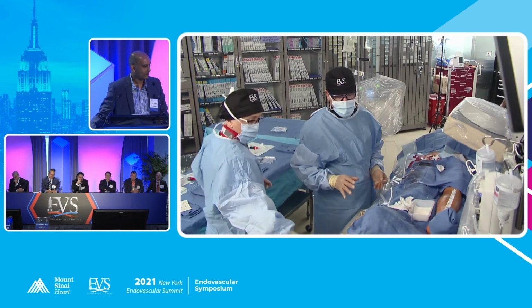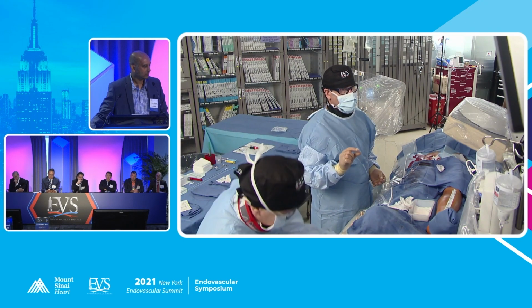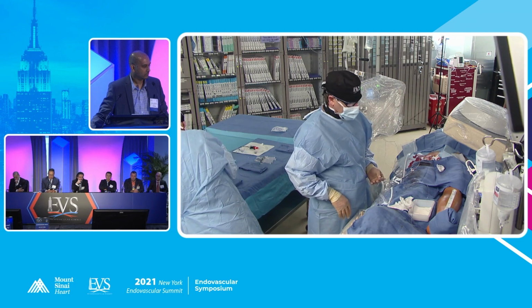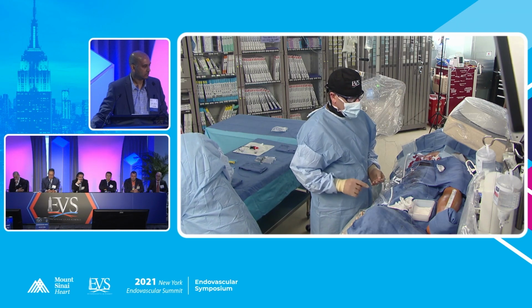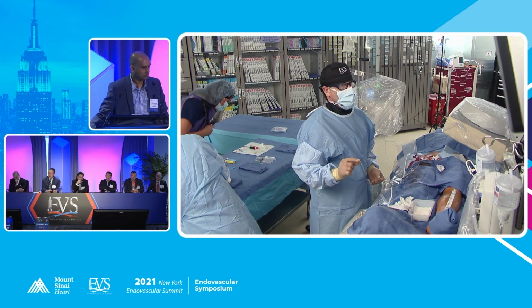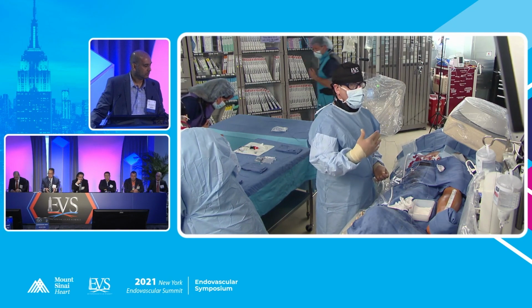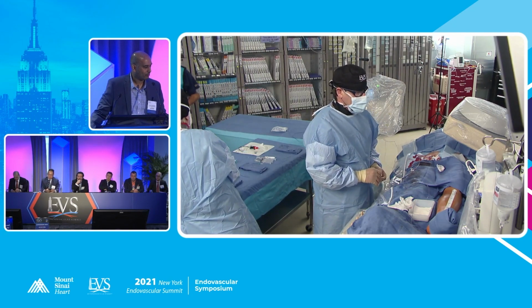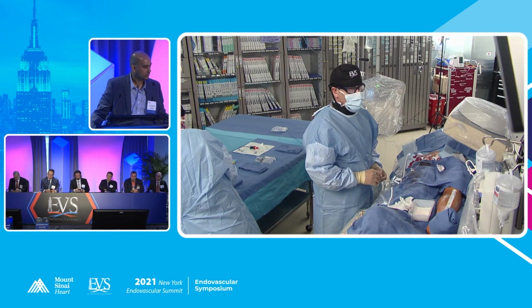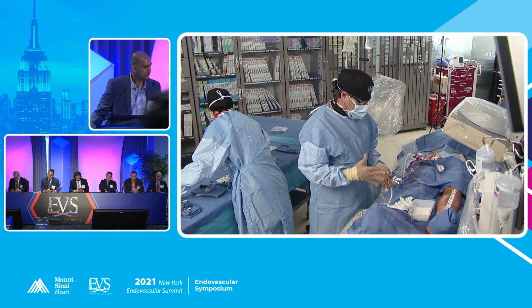And so the idea is, I think we can do this endo. If we do this correctly, we will not burn any bridges. And I do think we have technology now that allows us to at least consider this. Pretty soon, Shockwave will have an 8mm balloon, which will be even better. And as everybody knows, the drug-coated balloons go to 8, 9, and 10. So we have a drug-coated balloon that really matches the size of the vessel. I think below the knee, drug-eluting scaffolds work extremely well, and I think we'll be able to get inline flow.